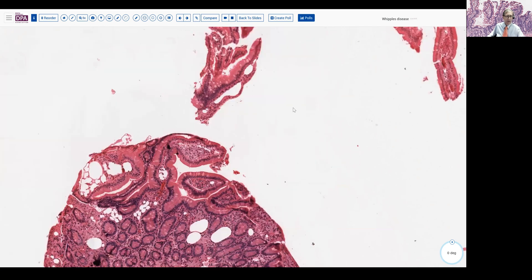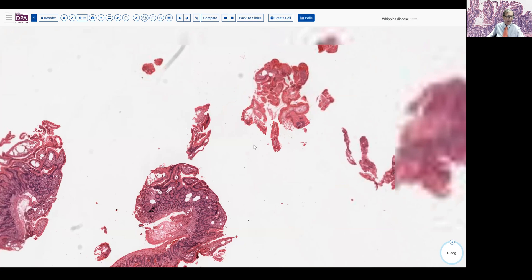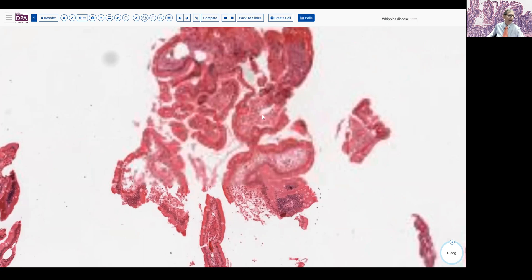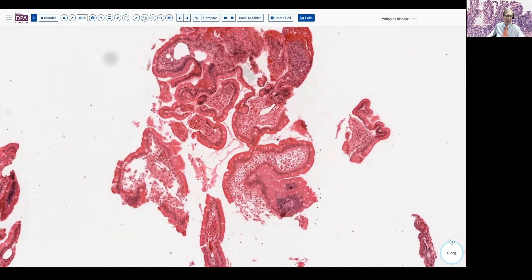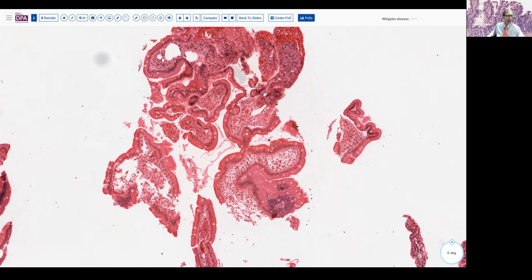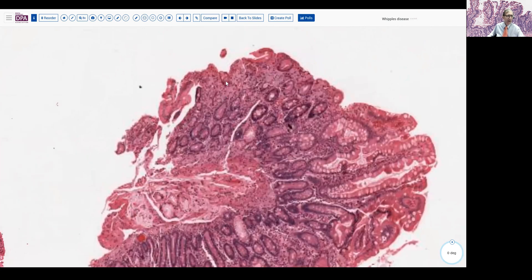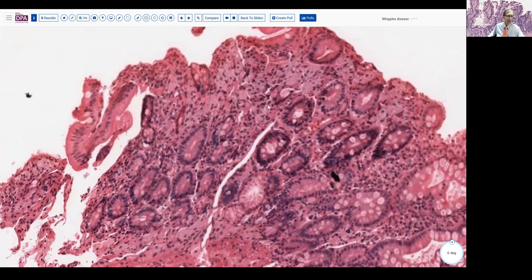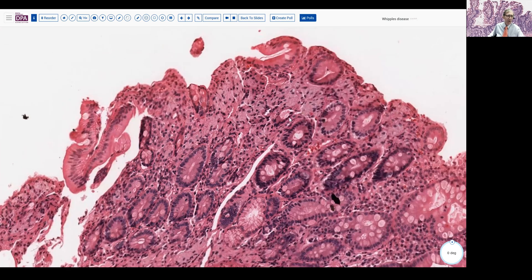We'll see if we've got another area here. Perhaps some similar changes — not very striking there. And in the last fragment, again here, we'll see a little bit of expansion of the lamina propria, kind of what we're expecting from that endoscopic appearance. And this sort of slightly pale foamy macrophage type of appearance. As we know, this can be a harbinger of infectious disorders. And so histochemical staining would be appropriate in this situation.